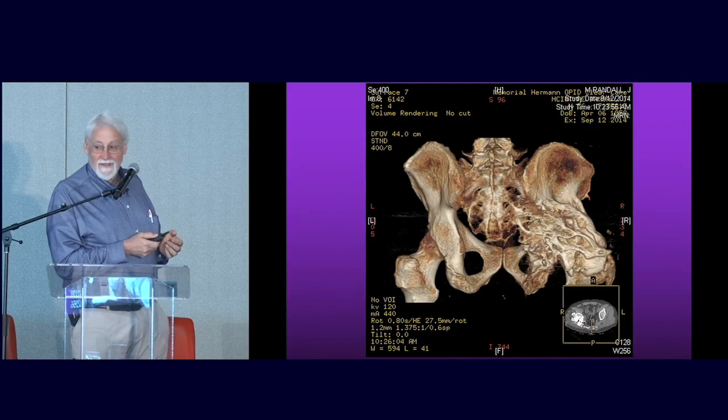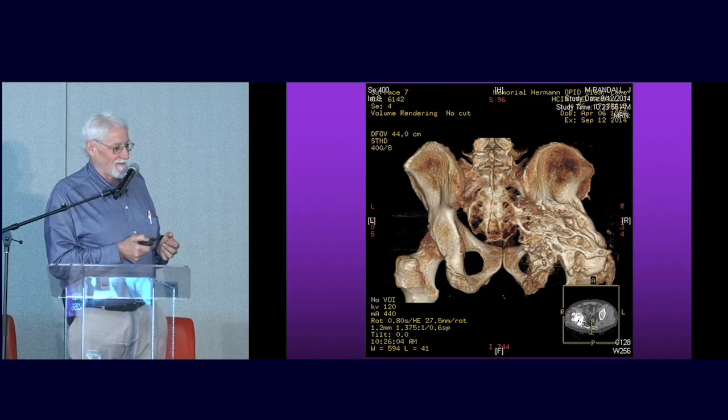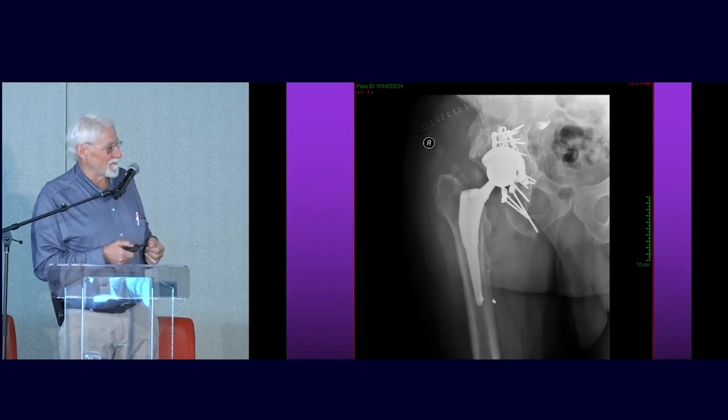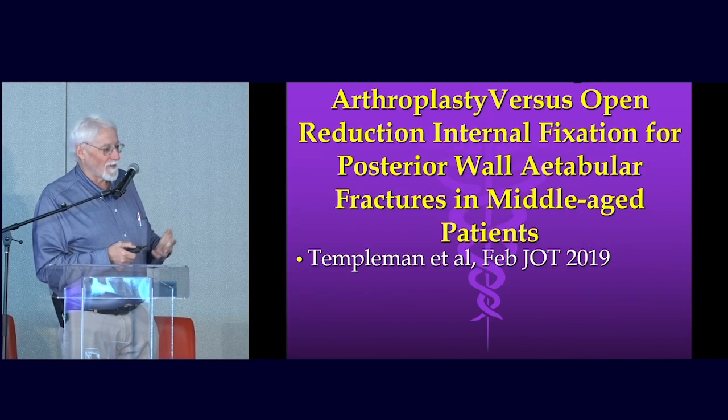Unfortunately, the patient eventually got to me, probably not wanting to. I have never seen a case like this before, so I'm showing you guys. The sciatic nerve is right in the center of all that. So it's a disaster, but we ended up teasing out the sciatic nerve and then doing a total hip.